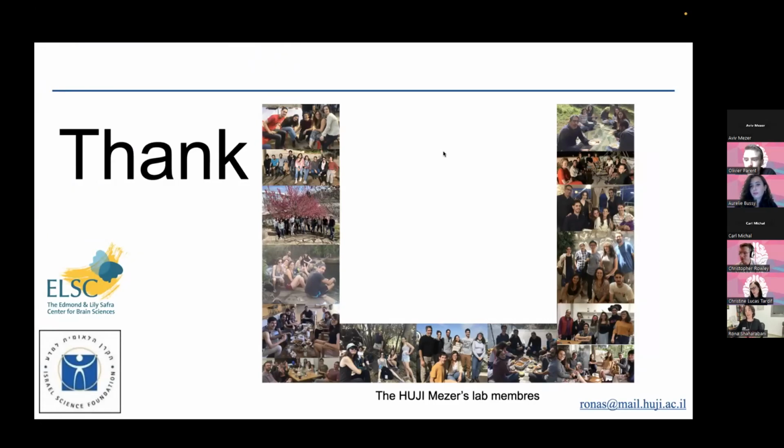Oh, yeah. So in the demyelination process, the membrane undergoes undulation. So there is a change between the gaps of the membrane, so the water thickness changes. So if we have an MRI marker that can tell us that we can physically measure the changes in the membrane, we have a marker to showcase the demyelination process. And again, if you have a drug that can resume the membrane to its original compact position, again, we have a measurable method to see these kind of changes.